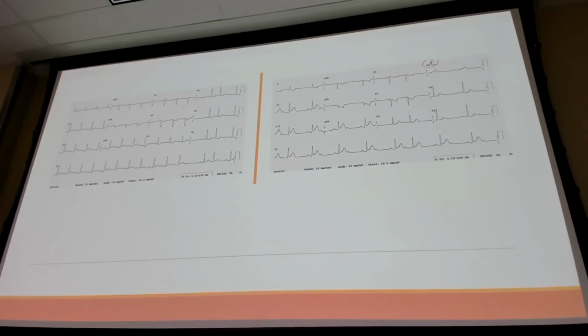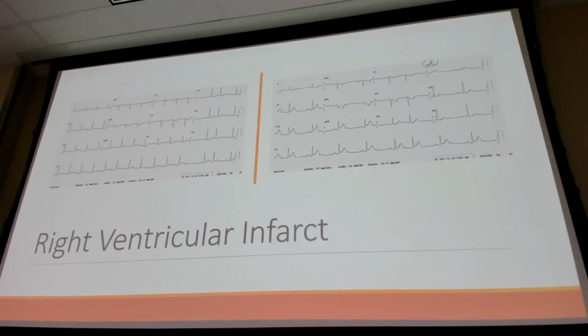Does it look like some sort of heart block? Does it get longer, then drop, like Wenckebach? Is it type 3, complete heart block? It doesn't look like it is. All right, yeah, there's a right ventricular infarct.